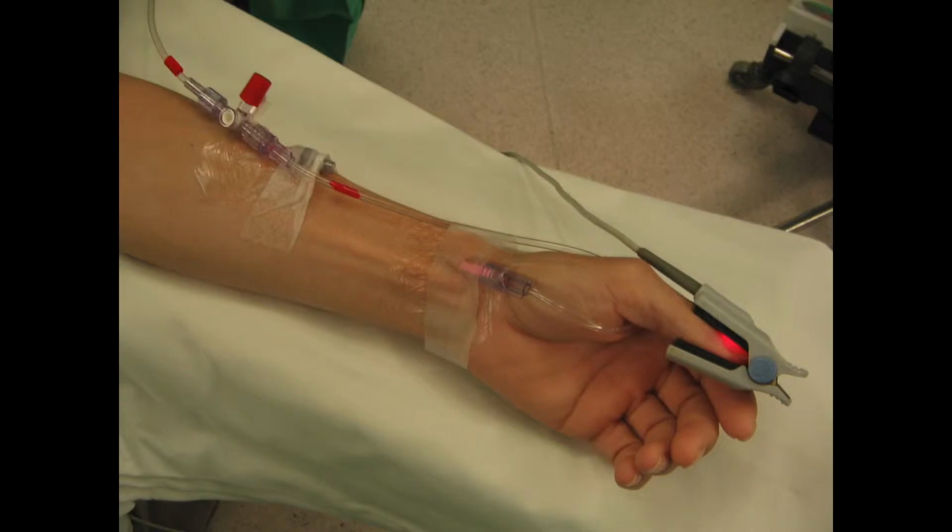So the procedure to assess arterial line waveform and ongoing safety and accuracy of arterial line measurements. First of all, you want to receive a bedside handover from the clinician in charge of patient care. You want to identify the goals of care for this current patient. So what mean arterial pressure are we currently aiming for? Are there any parameters in terms of systolic and diastolic limits, upper limits, lower limits? What current medications are being used to maintain that blood pressure or affect that blood pressure?